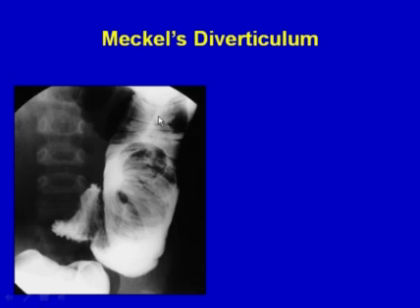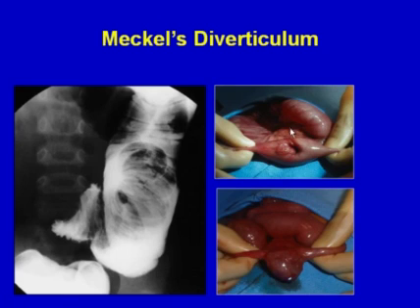And here is a patient who had a barium reduction. These are still done in some places. They are not, certainly in our experience, as efficacious as air, but some places people are still using contrast. And this is an older case, so we can see this mass that could not be reduced. And here it is at surgery.